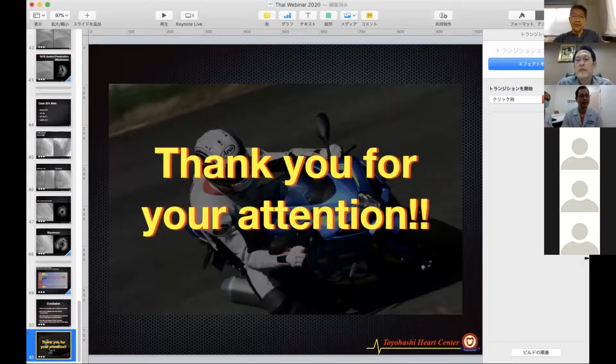Yes, thank you for your question. It's a little bit difficult because in my experience, it depends on the case. Usually when I need rotation on the Corsair, I start with counterclockwise rotation.